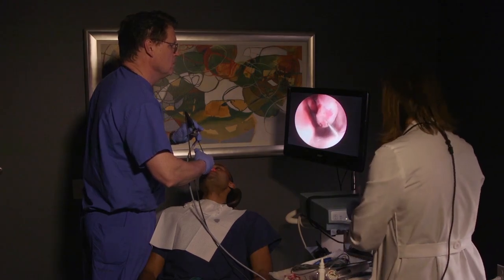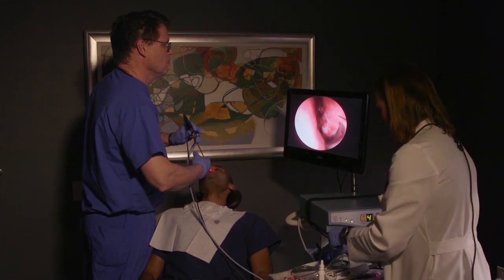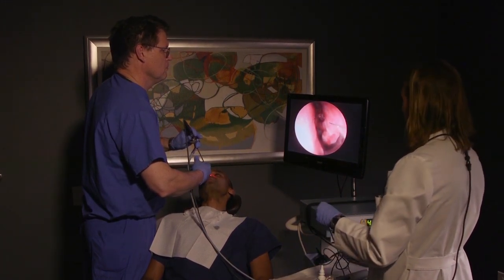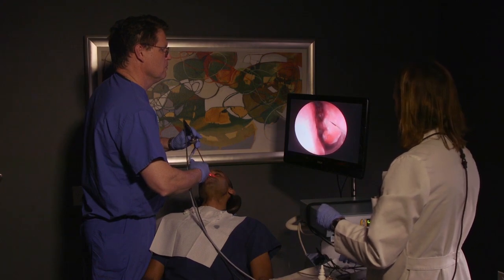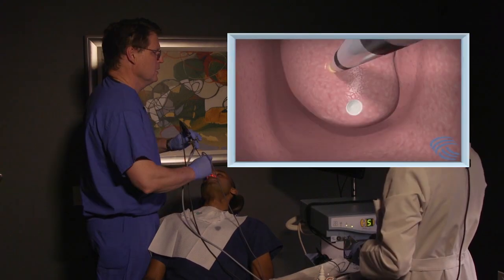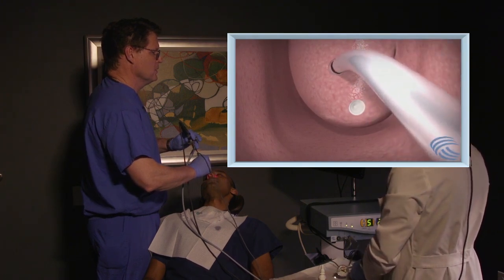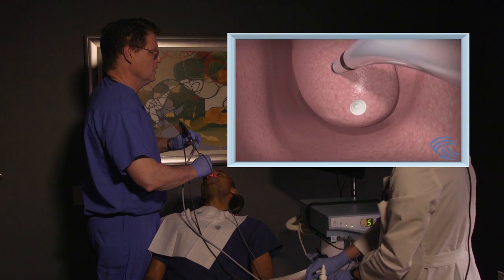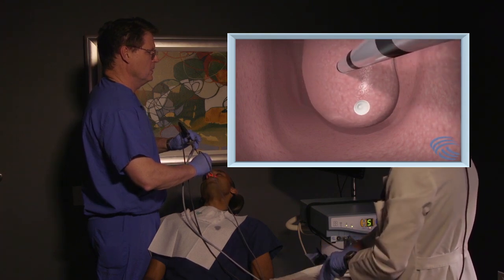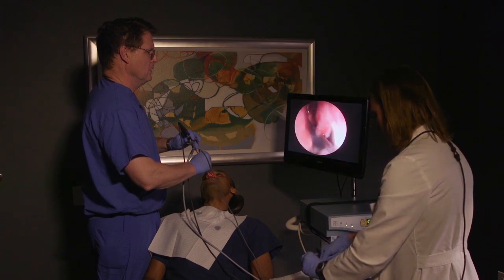We're going to switch gears over towards the breathing passageways, trying to reduce the turbulence. First thing we need to do is make sure things are nicely numb still — and I'm not feeling any of that, which is a good sign. A little smoke, a little pressure. I can smell smoke, which isn't really smoke, but it smells smoky. Otherwise, not a whole lot of action going on.